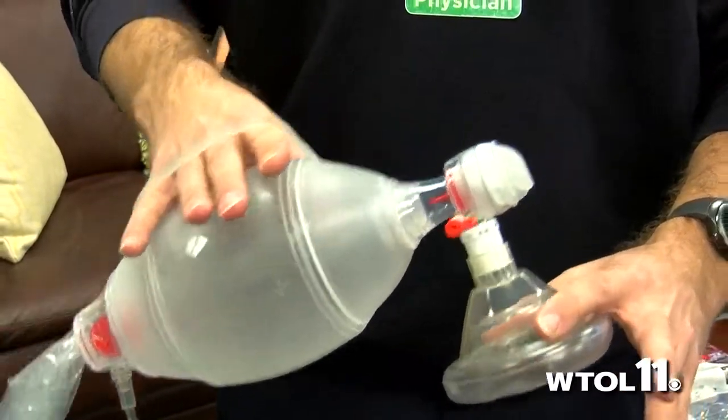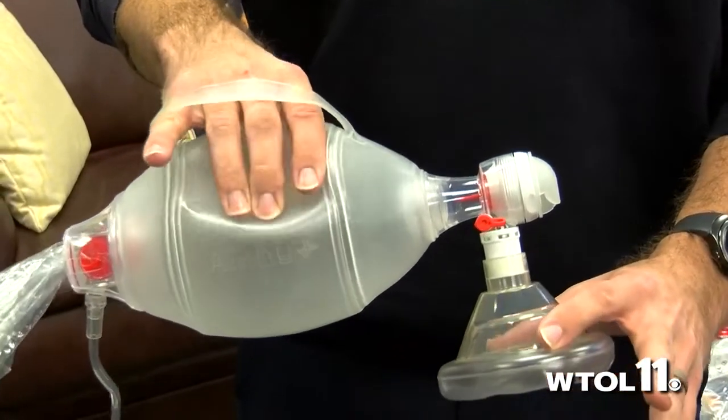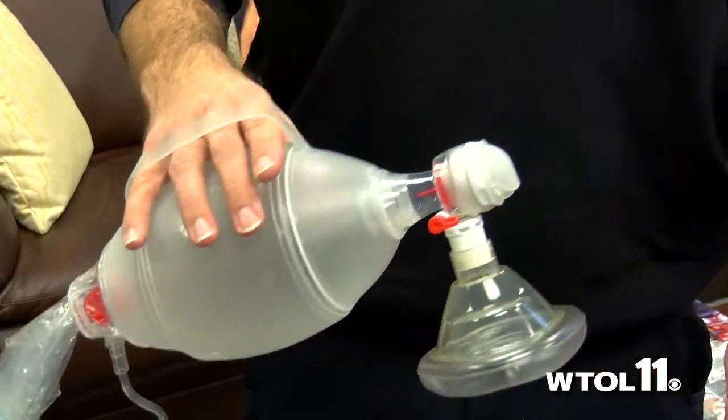When you squeeze this, it forces air straight into the lungs. Every time you breathe, the patient breathes — every five to six seconds. Breathe just until you see chest rise and fall, and then you know the air is going into the lungs.